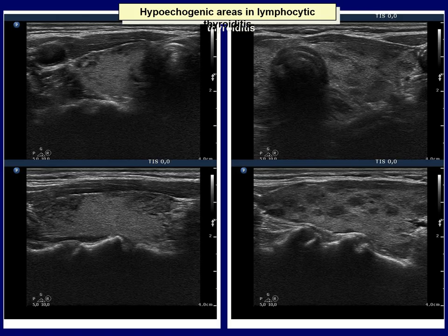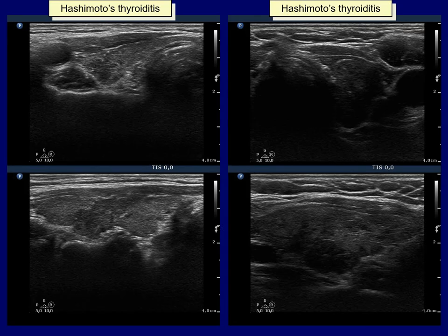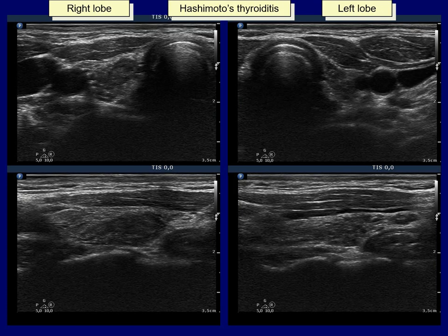I present some examples of Hashimoto's thyroiditis. This is the most characteristic presentation: numerous, relatively small hypoechoic areas within an echonormal background. These lesions have irregular, non-geometrical shapes and present with irregular borders. Note the multiplicity of the discrete areas. These two further cases are again relatively easy to judge — smaller and larger hypoechoic fields with irregular borders and non-geometrical shapes. Note that in one single section there are at least 5 smaller discrete lesions in the left and around 10 in the right patient. In a more difficult case, however, the non-geometrical shape and multiplicity of discrete lesions help avoid misinterpreting the largest hypoechoic lesion as a nodule.